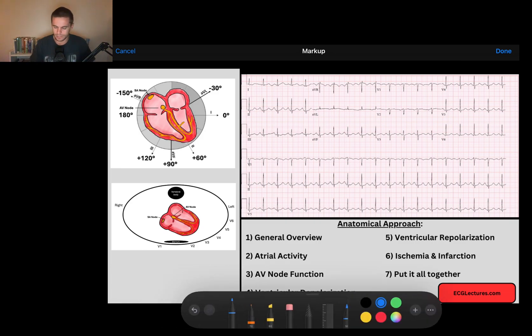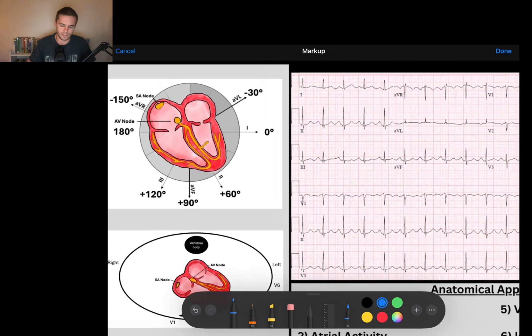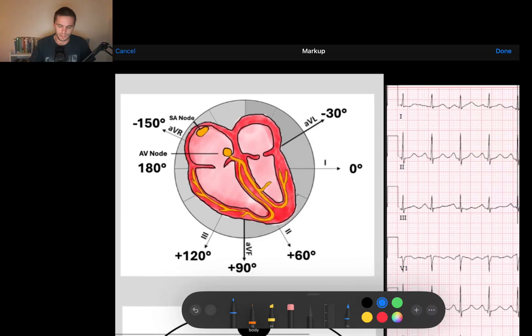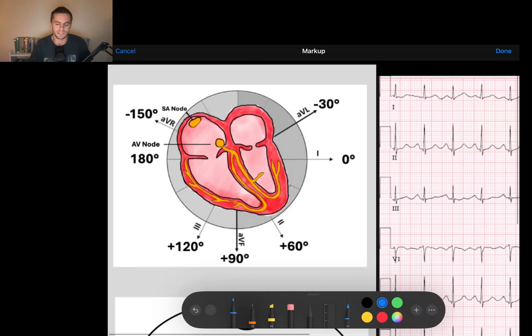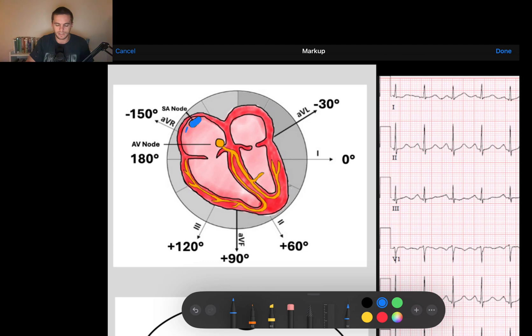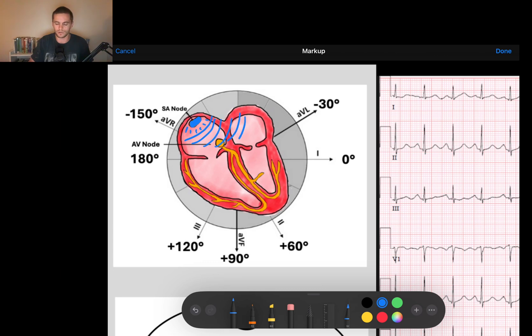The first thing is just remembering normal cardiac conduction. If I look up here, this is my Limley diagram. We have our sinus node that sits high within the right atrium, and as it paces, sends that nice signal, the atria depolarize away from the sinus node across the atria, causing the nice P wave.